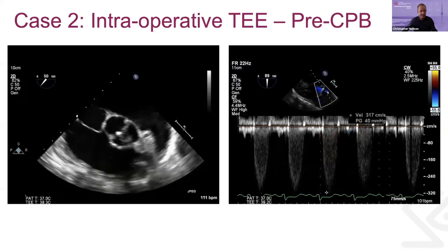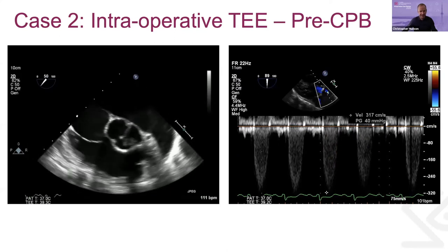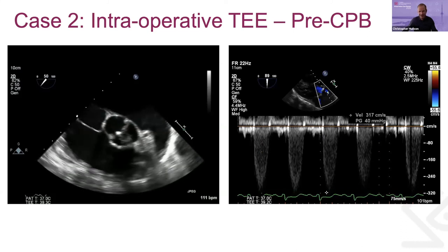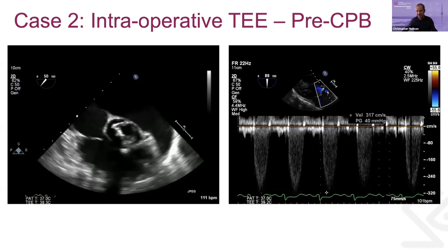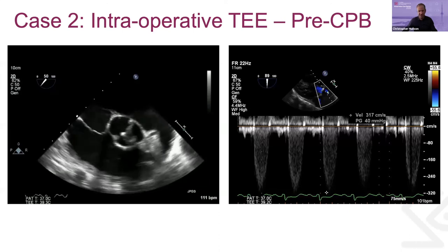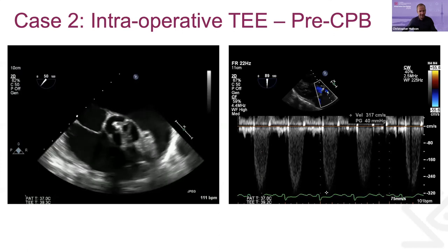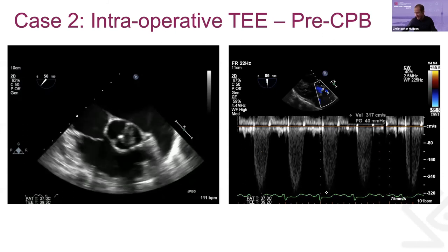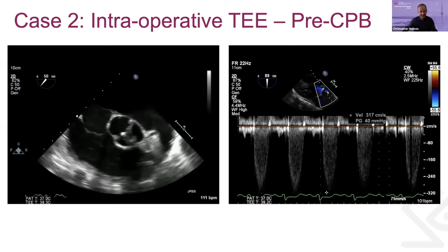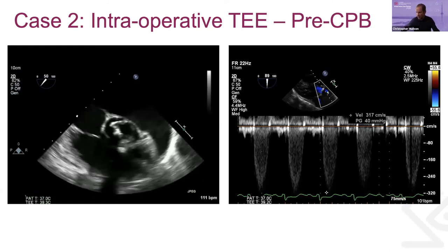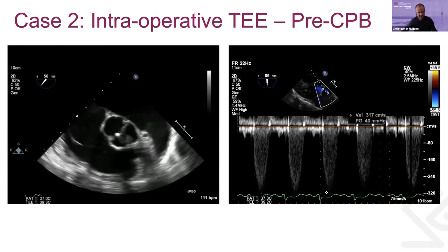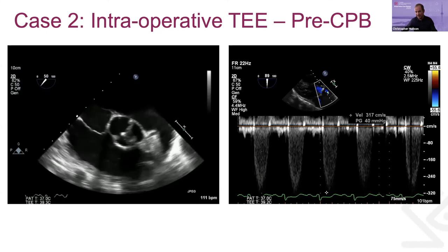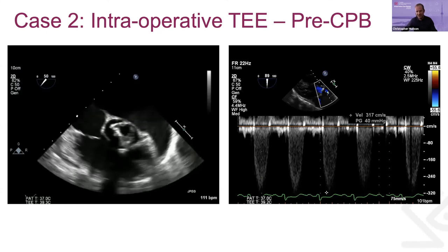Looking at the aortic valve in short axis, this is a very tight valve. This would be what was discussed earlier — a unicuspid aortic valve, extremely rare. About 5% of patients with AS who come in for aortic valve surgery have this, but in the general population it's closer to 0.02%. It can have one commissure or more, and patients with a unicuspid valve typically present early in life with aortic stenosis; it is also associated with dilatation of the aorta. On the right-hand side, we see a peak gradient of 40 and a mean gradient of 20 when that curve is traced.